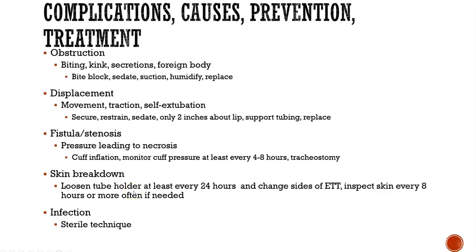It's got a little clip that you can just move from side to side, so that kind of helps decrease the risk of getting ulcerations and stuff in their mouth, and should help with skin breakdown as well, because it's not just sitting on their lip in the same spot 24/7.